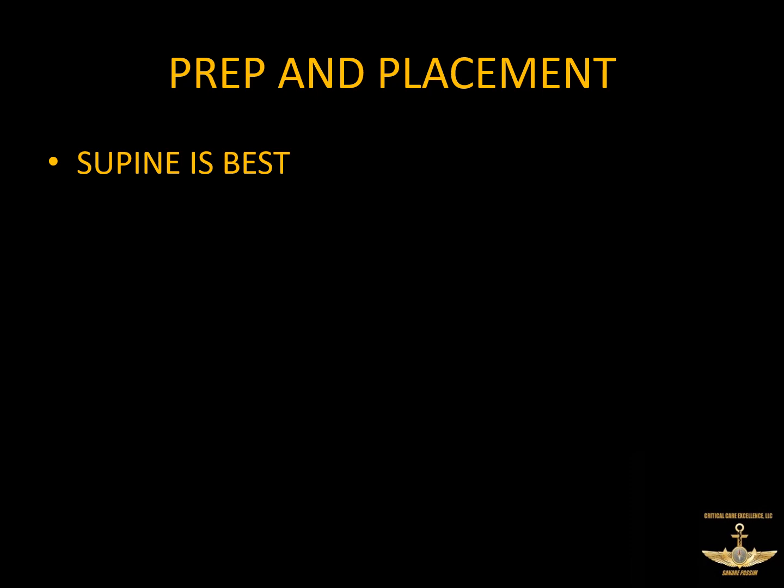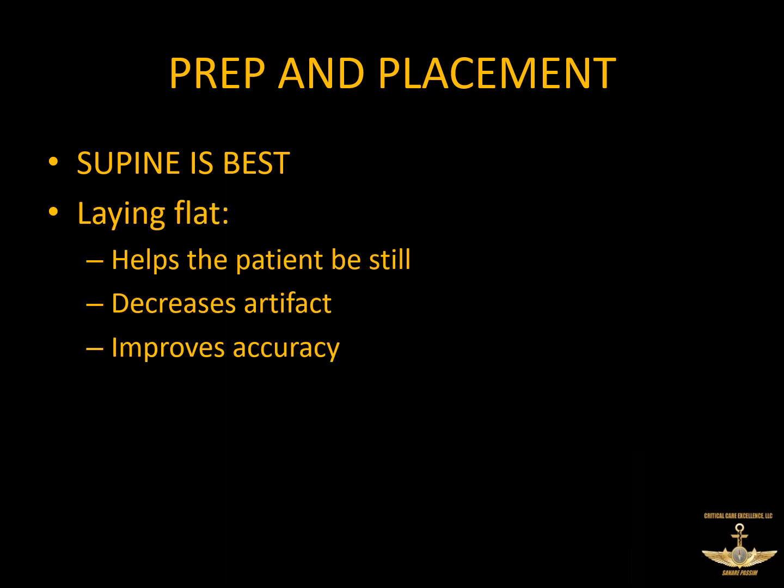And one of the first things is how you're going to position the patient. And positioning the patient, supine position is really the best. Now, I have to confess, I've never taken a patient who was sitting up and laid them flat to do an EKG, and most other people I talk to haven't either. But the only reason we talk about supine position is because laying flat will help the patient to be still, which is important.